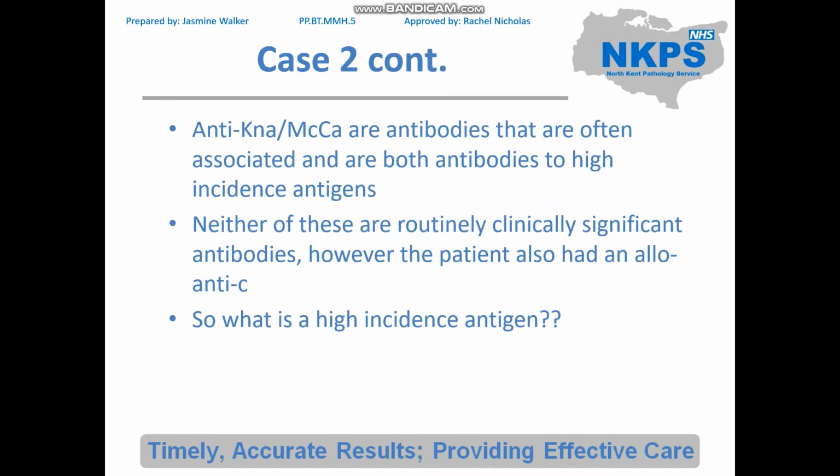However, they are denoted in that way because they are often associated. So it's just a nice way to say that normally they are linked. So both of these antibodies are antibodies to high incidence antigens. Neither are routinely clinically significant. However, the patient also had an allo anti-little c.